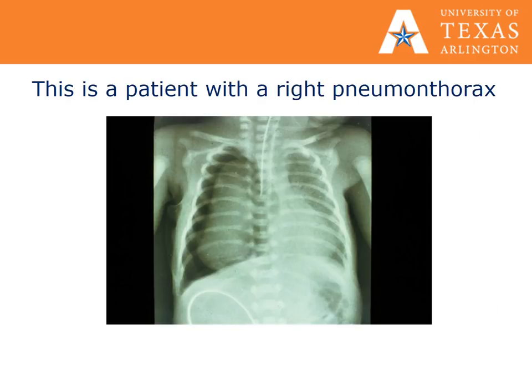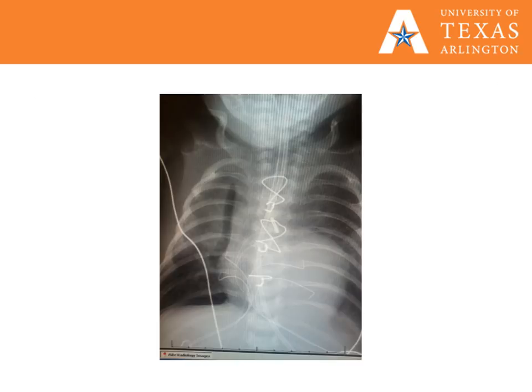Bowing may be seen with a pneumothorax. This is a patient with a pneumothorax on their right side. This is another patient with a pneumothorax after chest tube removal. You can see the tract left after the tube was removed is filled with air. This patient most likely had cardiac surgery — note the sternal wires and pacing wires in the chest.